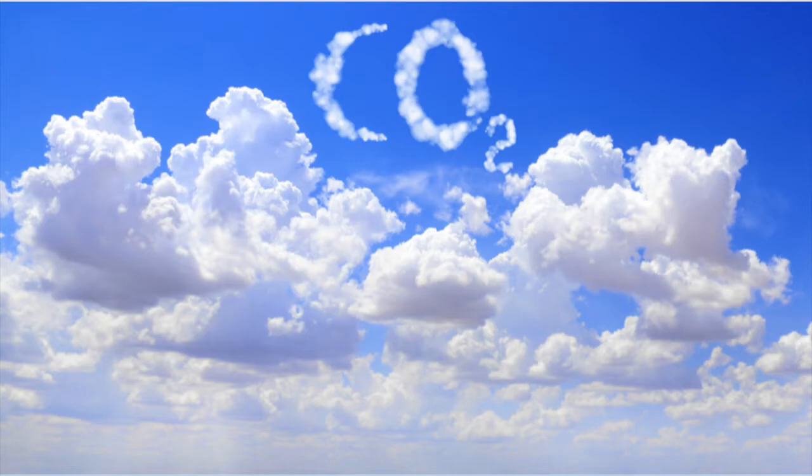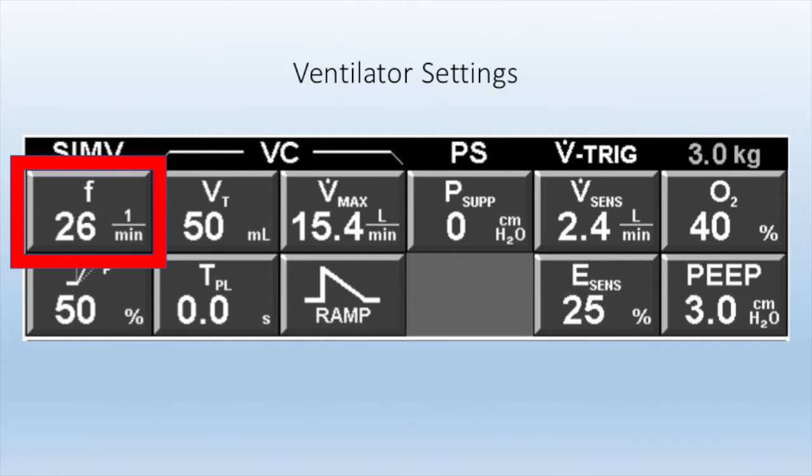This value can also be assessed both invasively and non-invasively through either a quantitative end-tidal CO2 detection device or the PaCO2 value on an arterial blood gas. Derangements involving carbon dioxide are mitigated by adjusting minute volume, and much like before, this can be done in one of two ways. Remember that minute volume is the product of respiratory rate and tidal volume. The first parameter that affects minute volume is the frequency or rate of respiration. In an adult patient, this tends to provide the most change with the littlest effort.